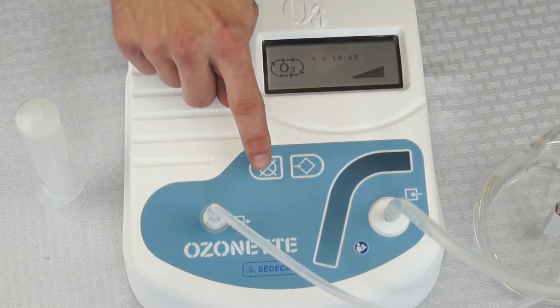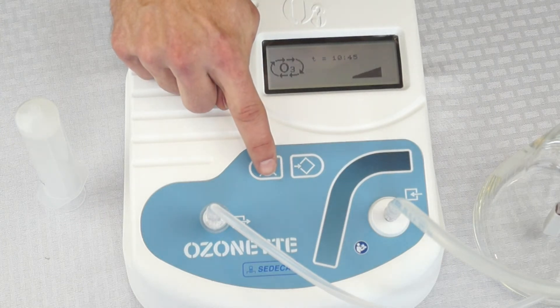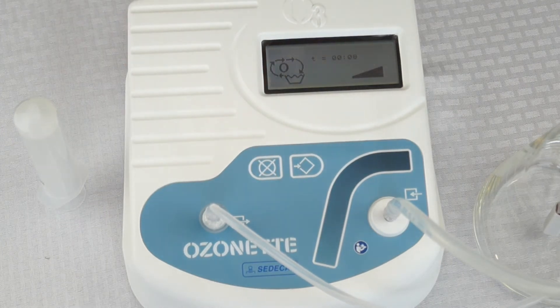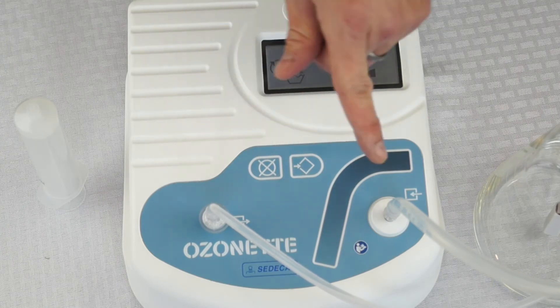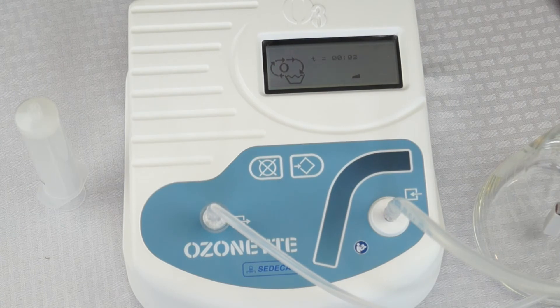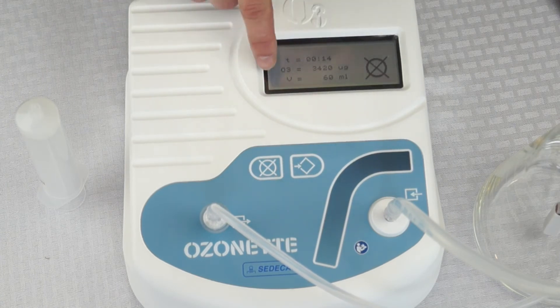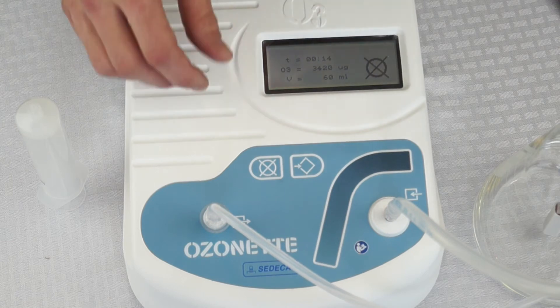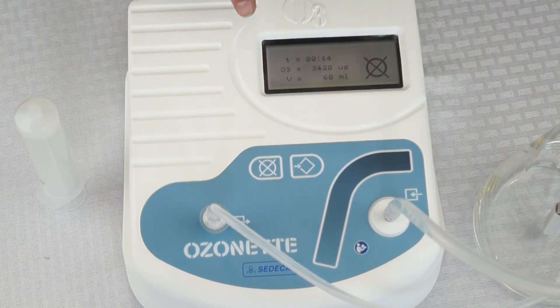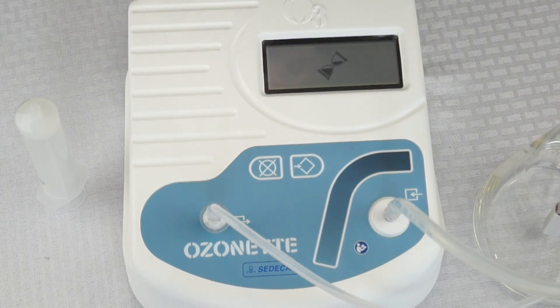If you want to cancel, just hit cancel. It will flow oxygen through the tube to purge any remaining ozone when you cancel out of that setting, and it will display the final dose on the final screen. That is continuous flow mode. If you want to run the same procedure again, hit enter and it will repeat that exact procedure.